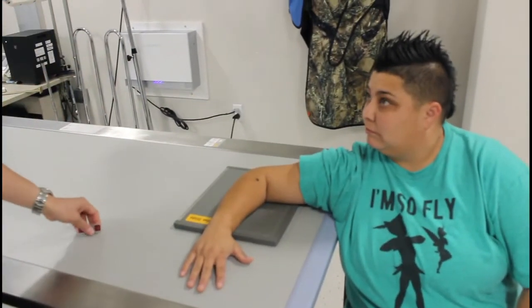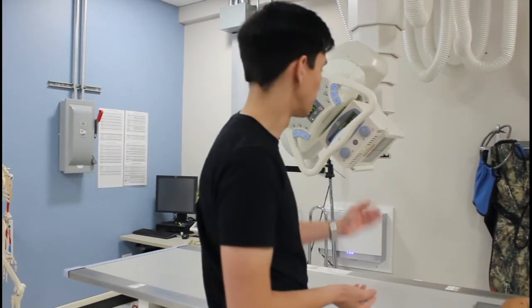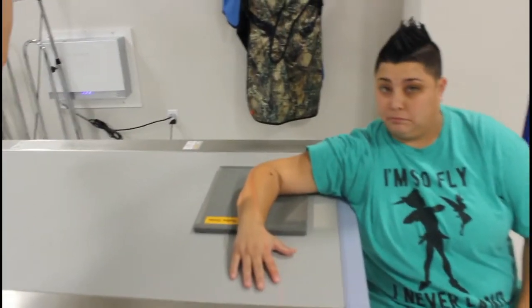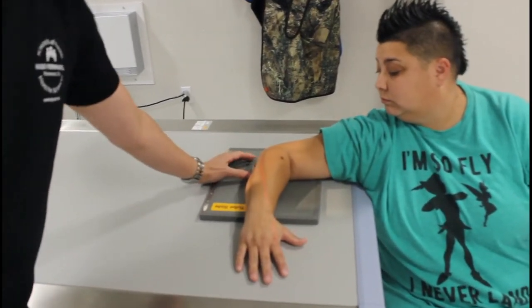Good. Our SID should always be 40, even though Merrill states that to increase spatial resolution, your SID should be 44 to 48 inches. So as you can see, we're centered on the radial head. We have a nice open collimation. I'm going to place our marker on the lateral border and ensure we shield our patient.